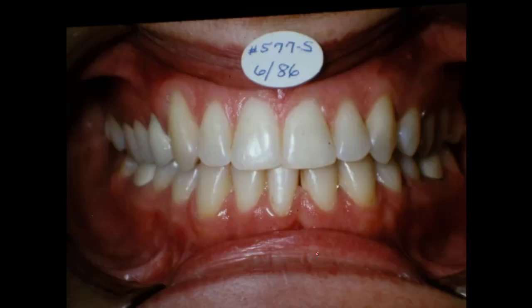So anyway, here are the teeth. Now the right central is right dead center. See, right down through there. And you got a little space here, but not much. You need to keep that cleaned out. But it worked out nice, you see. These teeth are fitting in good class 1 relation. She's got an overbite and overjet, and she can bring her jaw forward out here and close and cut stuff off like people normally would. She's not an edge-to-edge person. Some of this was tooth size discrepancy, and some of it was caused, I think, by those big tori that were back in here.